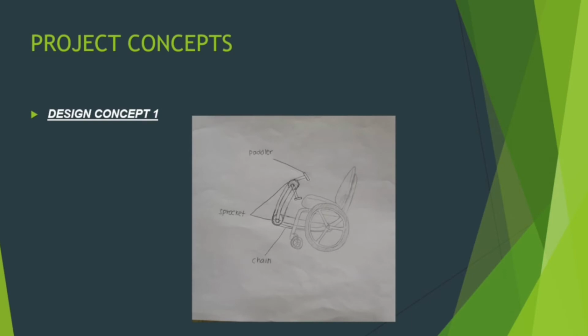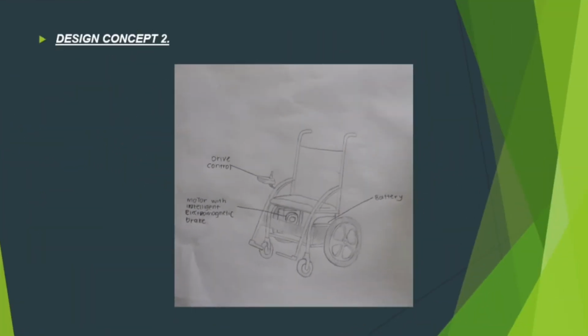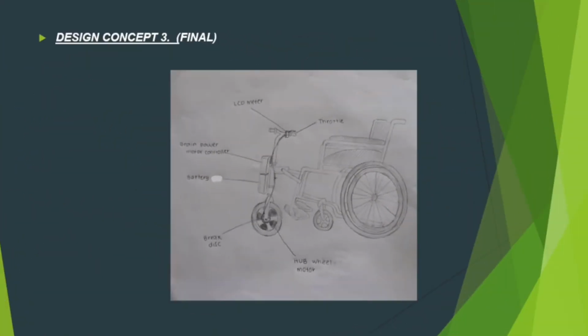Project concept. Design concept 1. Design concept 2. Design concept 3, final.